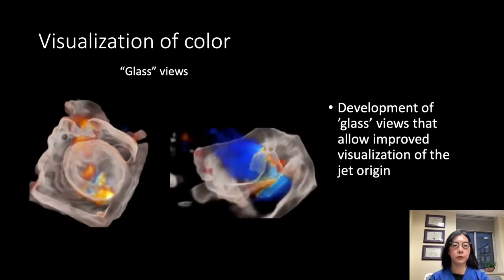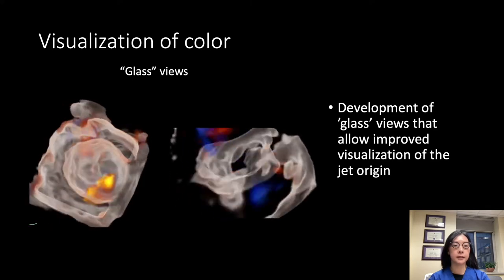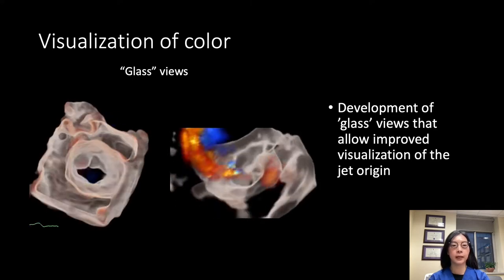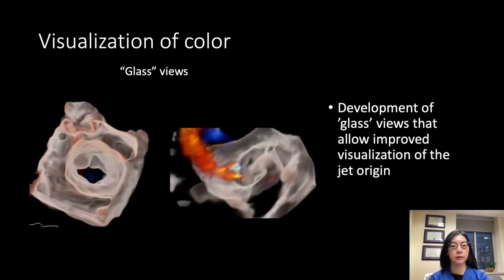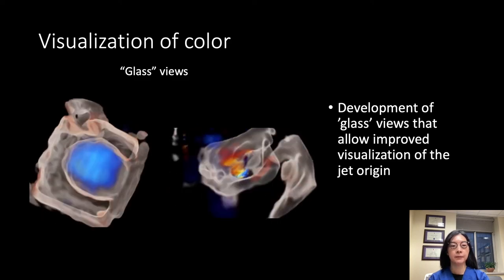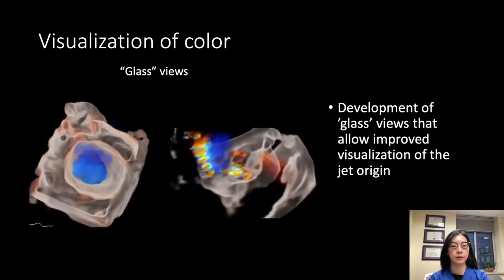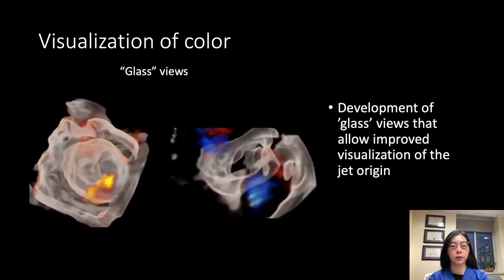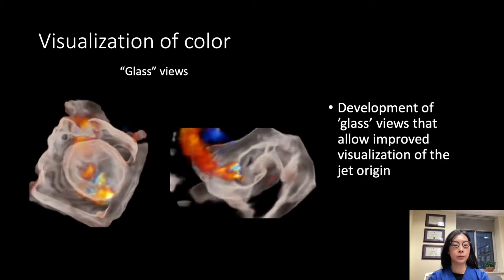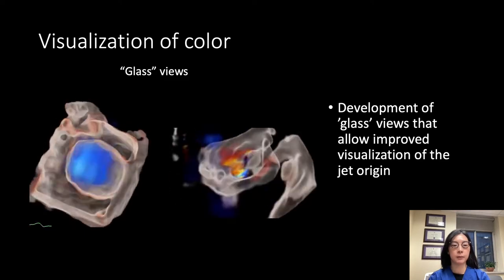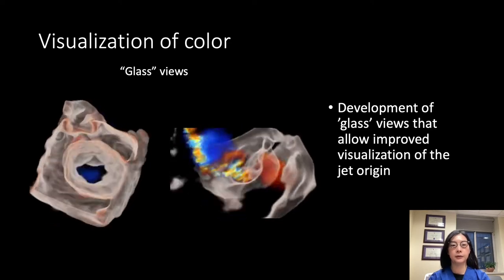Another development improving communication with surgeons and interventionists is something called the glass mode, where tissues are rendered transparent, with different layers of transparency available. The biggest advantage is that you can actually see where jets are coming from with the underlying structure still in place. For catheter procedures, this is where you could place your clip and see both the tissue without dropping out the mitral valve tissue, as well as the clip.